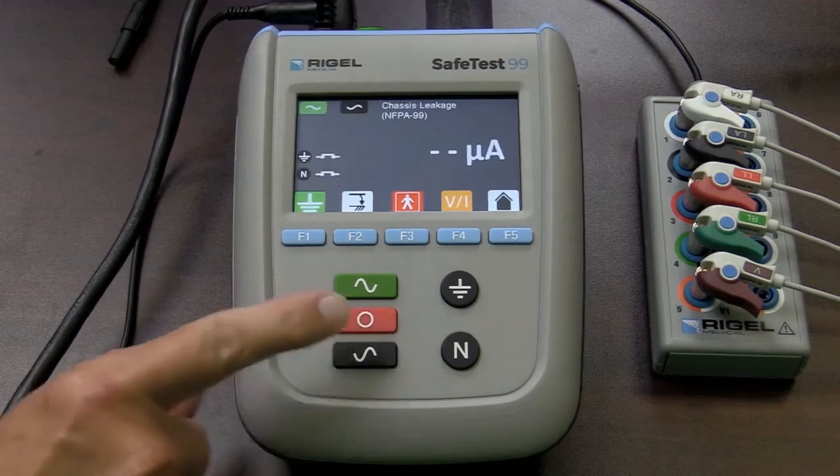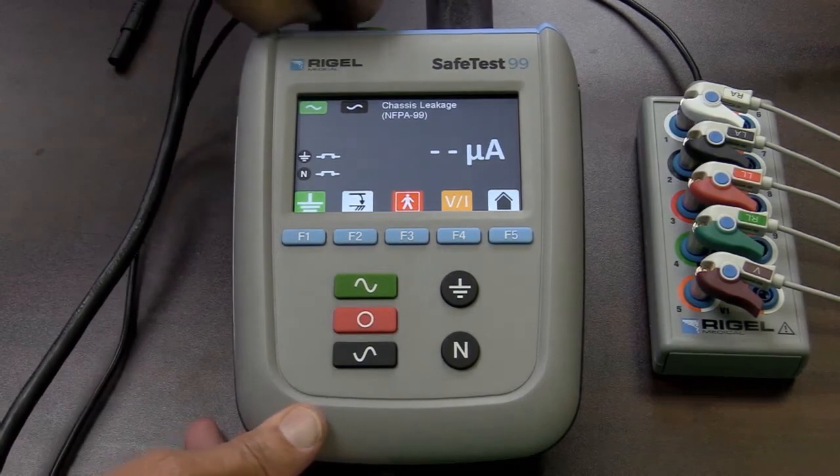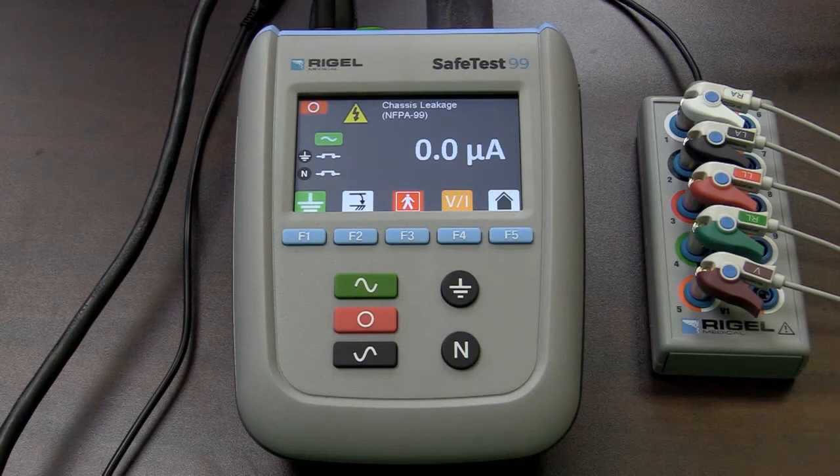I'm going to turn my device off and change my connection from the Kelvin connection going to that ground pin to my adapter box so I can look at my patient leads. I'm going to again put power to the device under test socket. The little yellow warning symbol comes up showing me that I do have power going to my device. There is my normal operating condition. I'll lift my ground, and there is my single fault condition — the leakage that the patient could be exposed to if they came in contact with the device itself.